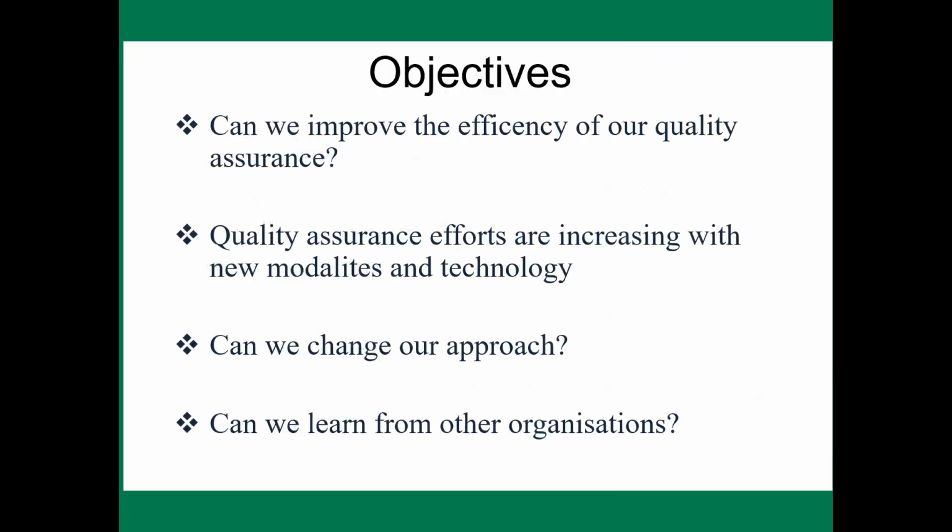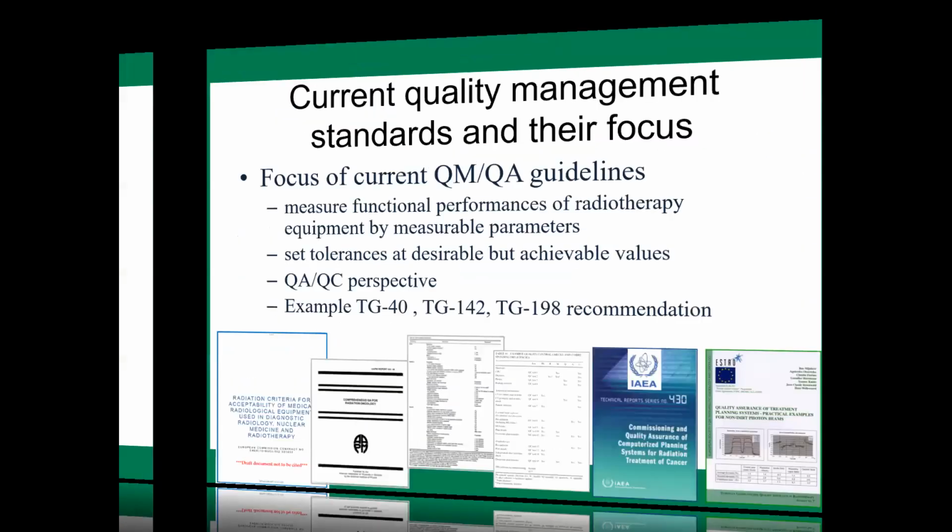So the objective of this presentation is to brainstorm about whether we can improve the efficiency of our quality assurance. Quality assurance efforts are increasing with the new modalities and technology. Can we change our approach? Can we learn from other organizations? Are we open for that?